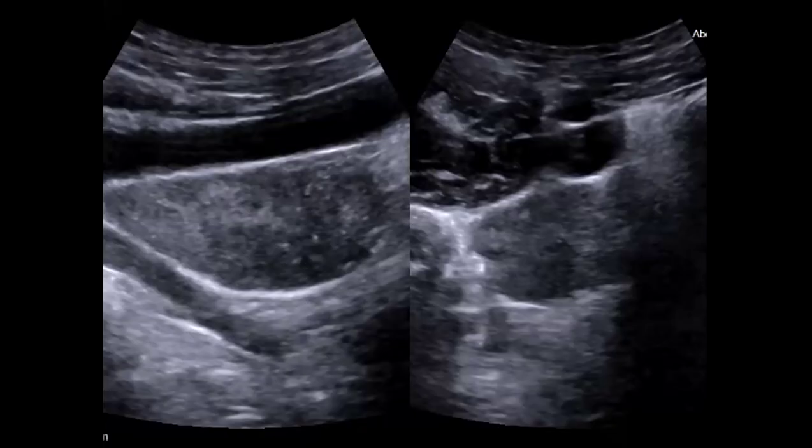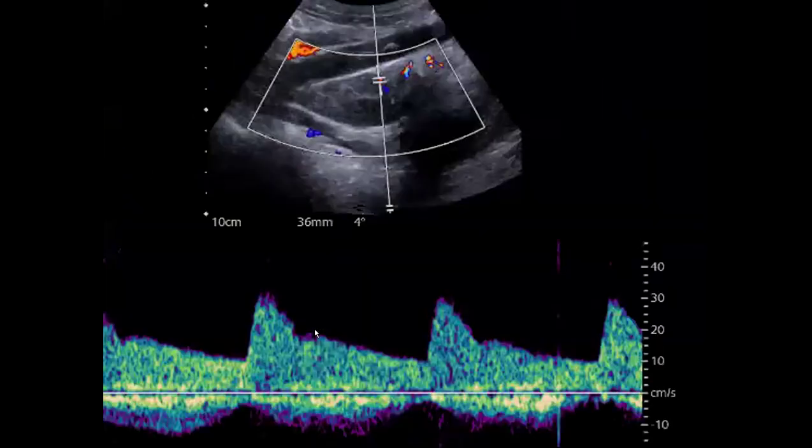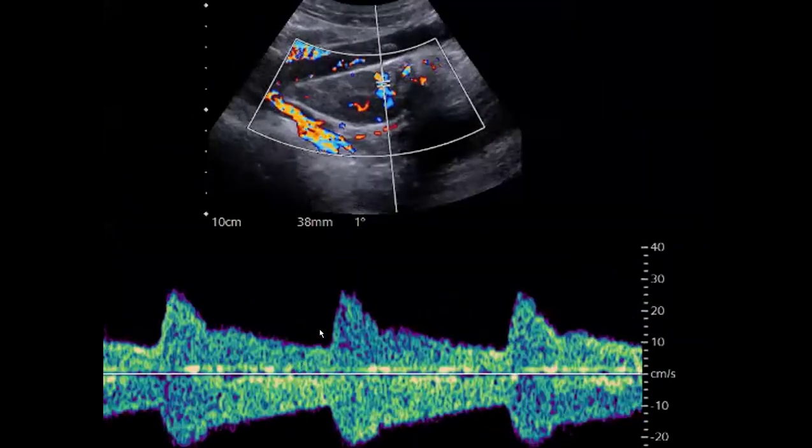That's a very good thought. So let's see what the adnexa shows. We are showing the right adnexa right now. This is longitudinal and this is transverse. We see this structure in the right adnexa. Left adnexa, similar structure. No hint of follicle, right? These are hypoechoic. Maybe you get the undescended testicles. Perfect. Yes, these are undescended testicles.